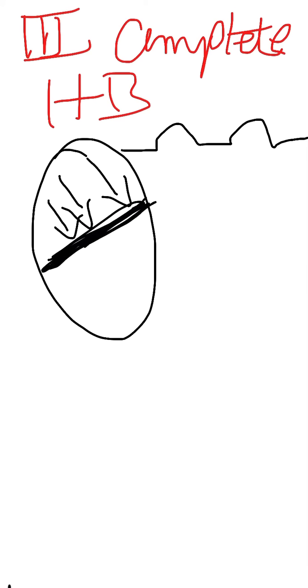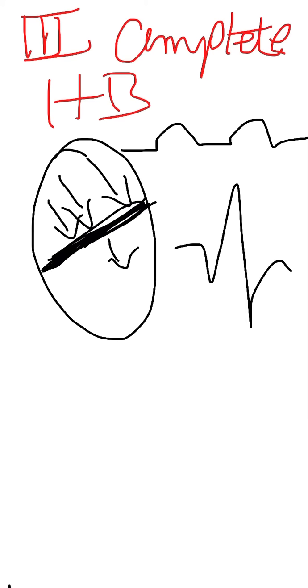And then in its own time, the AV is going to shoot out impulses, all right, that are not even in sync with when it received the P wave, because it has delayed so much. So once that happens, that is when you're going to have the QRS happening. So in this type, you're going to find no synchronization.